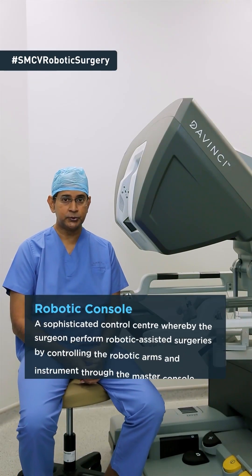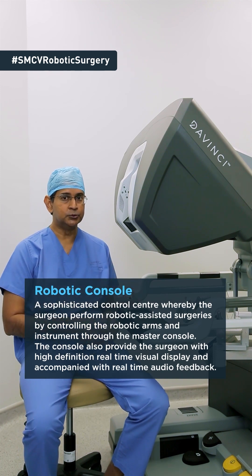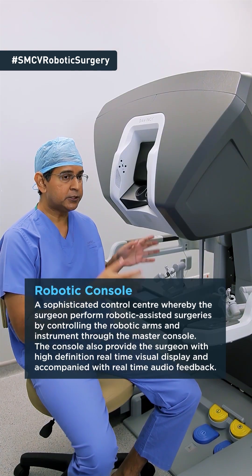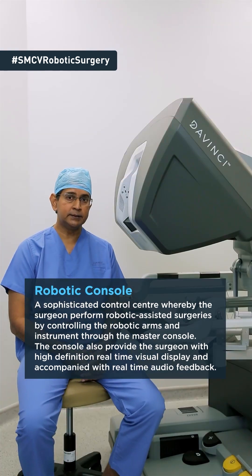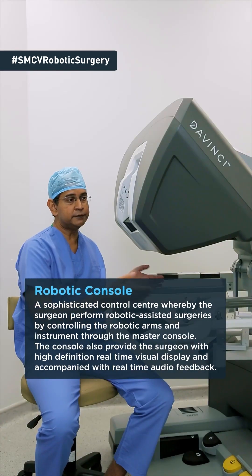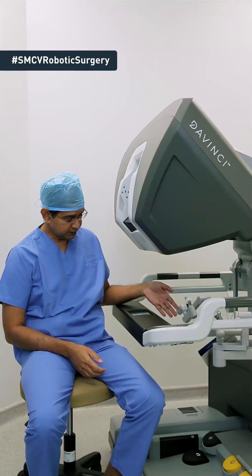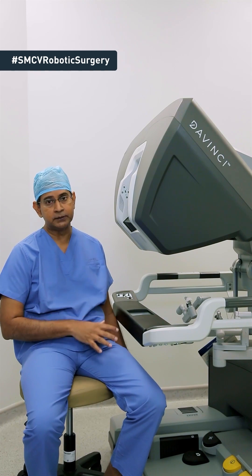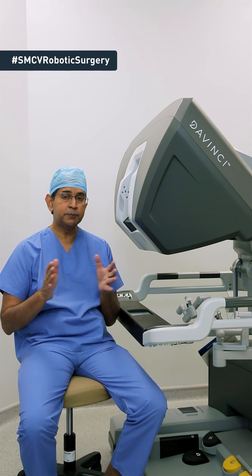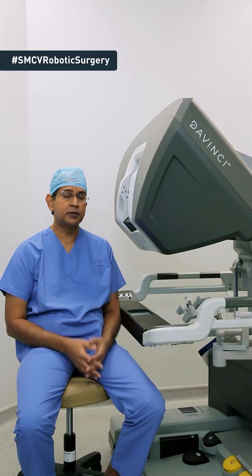I'm now seated at the robotic console and this is where your surgeon would normally be seated to operate the robotic arms and the instruments I've just shown you. The way that we control the surgical arm and the instruments is by using the master control shown over here. We can visualize whatever is in your tummy by looking through the eyepiece. Down at the bottom we have some pedals which we use with our foot to manipulate the camera so that we can look at the various parts of your tummy.